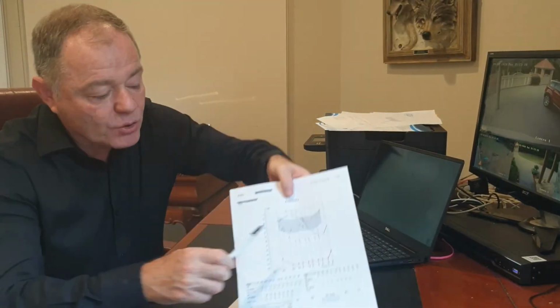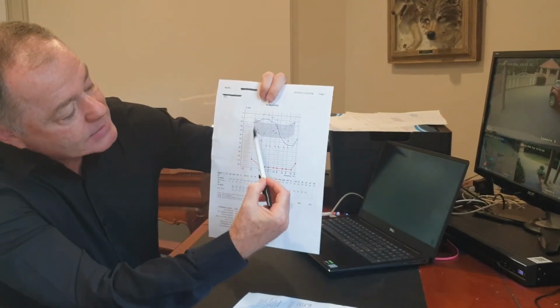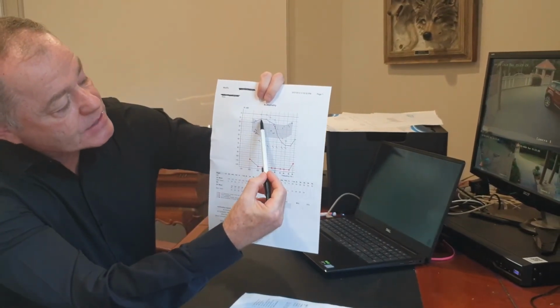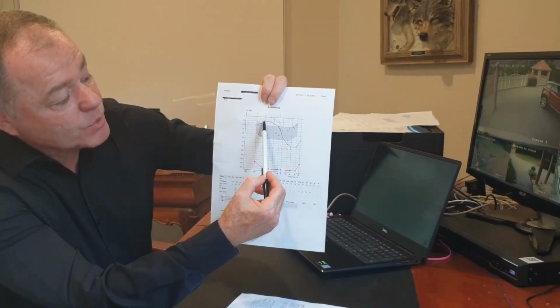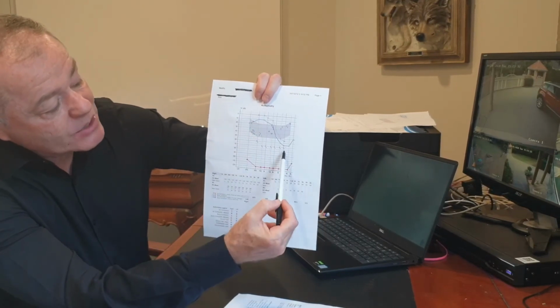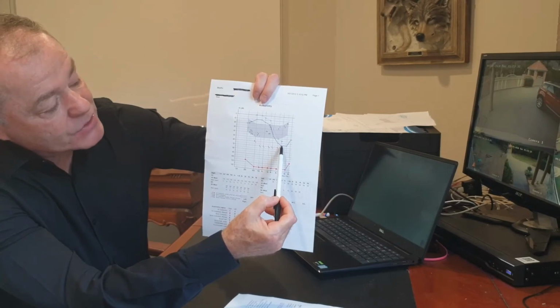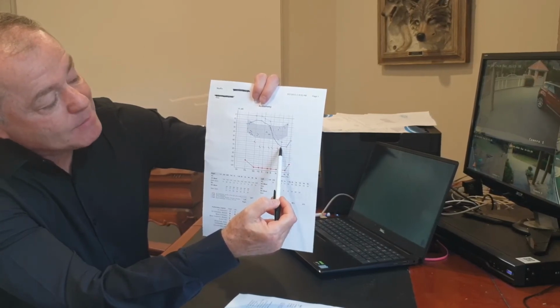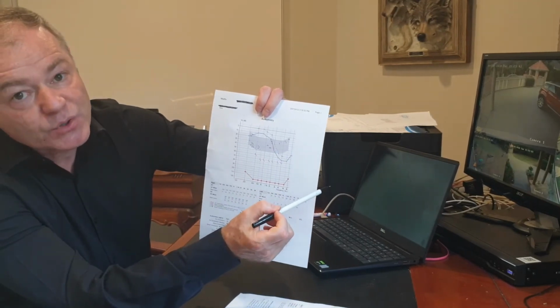So if you were to have a look at this loss here, for instance, at 500 hertz, this person has lost 10 decibels. So with a hearing aid, we would want to bring that up from 10 all the way back to 0. And if you've got a loss over here of about 65 decibels, obviously we'd want to amplify that much more, because we've got to bring that all the way back up here to make that audible as well.